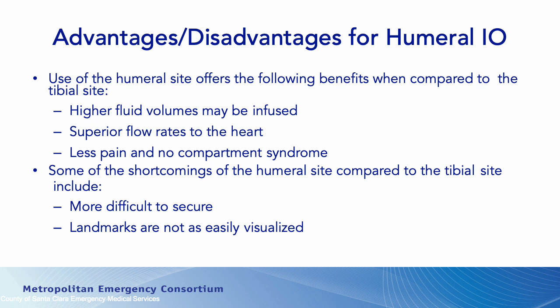Some of the shortcomings: it could be more difficult to secure. The landmarks are not as easily visualized or palpable, particularly if you get a large patient or somebody who bodybuilds. You may not be able to as easily palpate the landmarks through the overlying deltoid muscle. Another potential shortcoming, and I think this is debatable, is whether you can get to the humeral site adequately or quickly enough when you're actively compressing the patient, simply because there are other priorities going on. Some people think that if you're switching off side to side for your compressors, you should be able to get in there, get the landmarks, and get the bone drill.